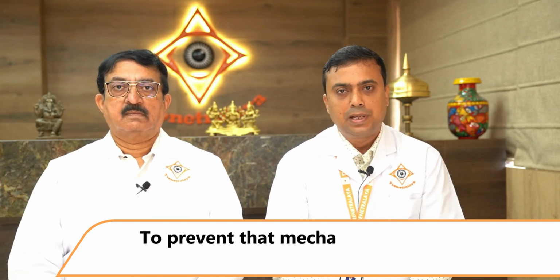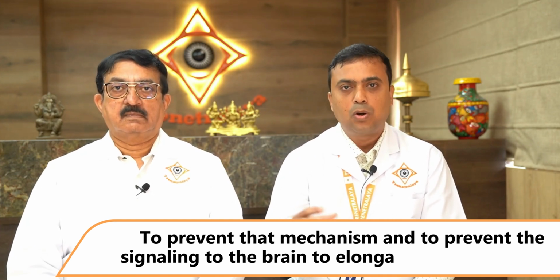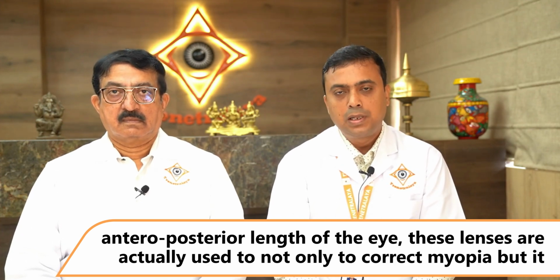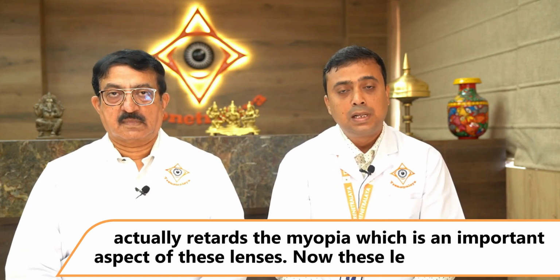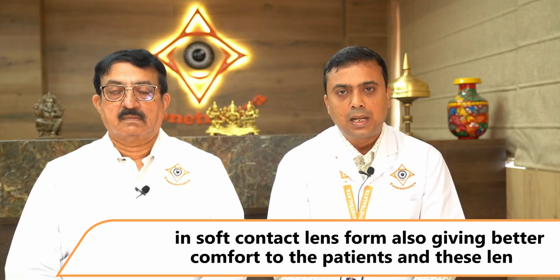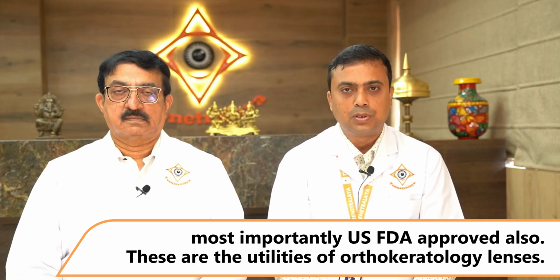To prevent that mechanism, and to prevent signaling to the brain to elongate or increase the anterior posterior length, these lenses are used not only to correct myopia, but they also retard the myopia, which is an important aspect of the lens. Now these lenses are coming in soft contact lens form also, giving even better comfort to the patient, and these lenses most importantly are US FDA approved also. So these are the utilities of orthokeratology.